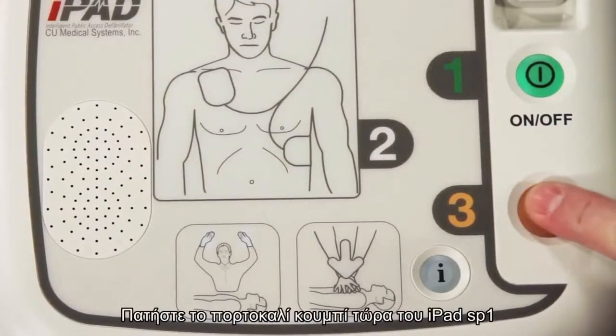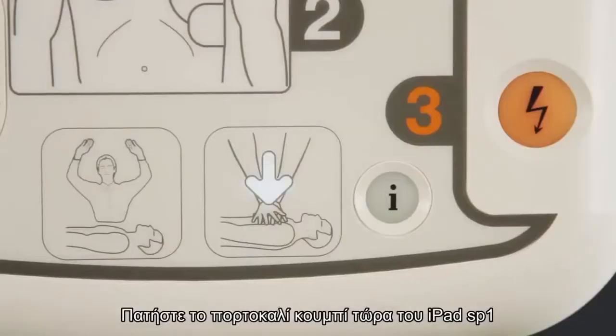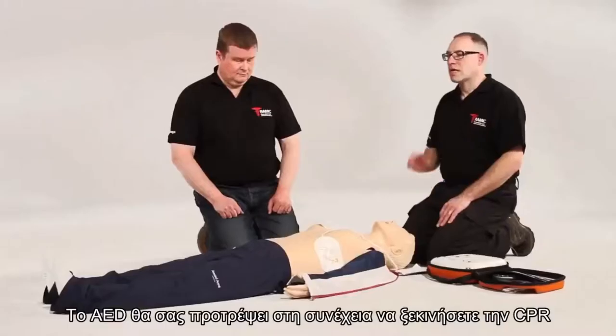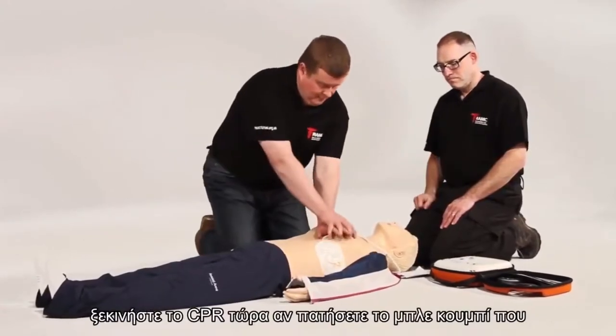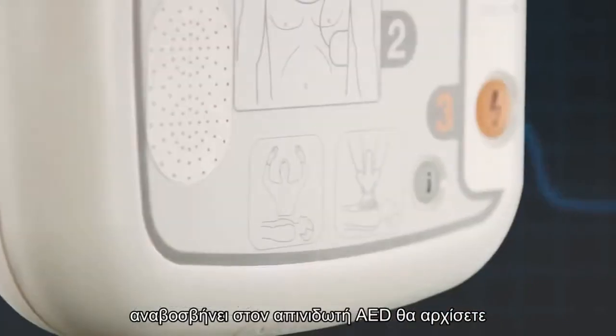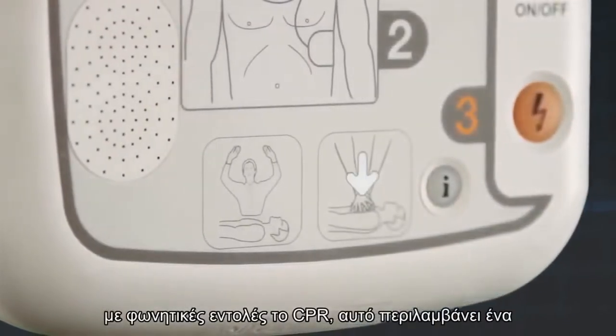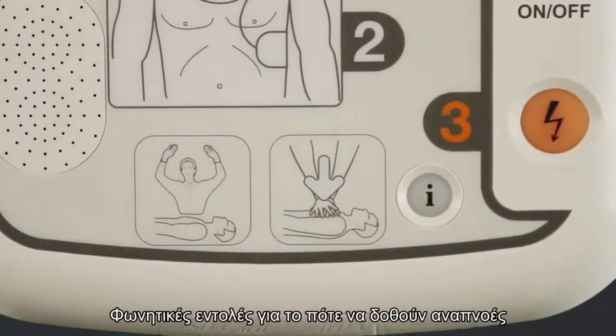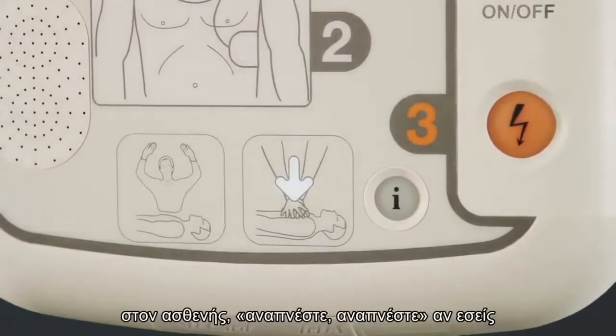Press the flashing orange button now. The iPad SP1 AED will then prompt you to commence CPR. Begin CPR now. If you press the flashing blue I button, the AED will commence with CPR voice prompts.